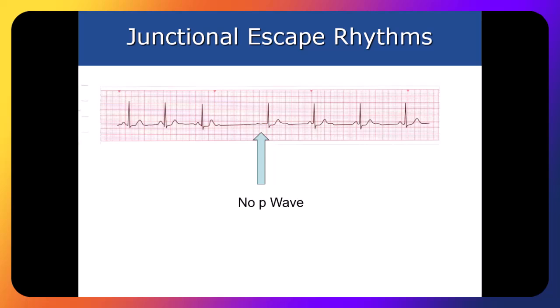Anybody got any questions? Yes, Dylan. So the junctional escape rhythm, does it essentially follow the same guideline as the sinus block, except there won't be a normal P wave before it? Yeah, I think that's a good way to put that.